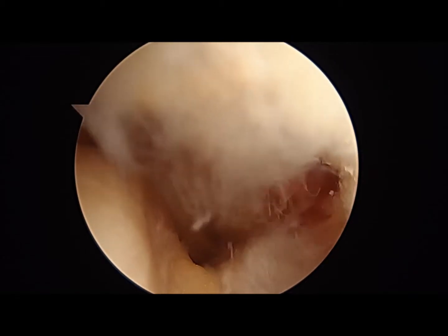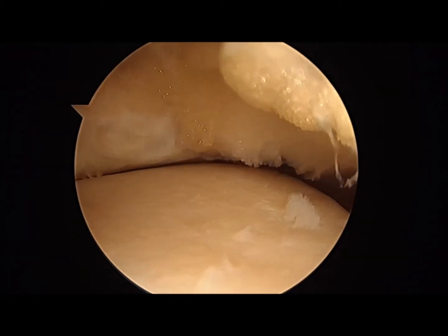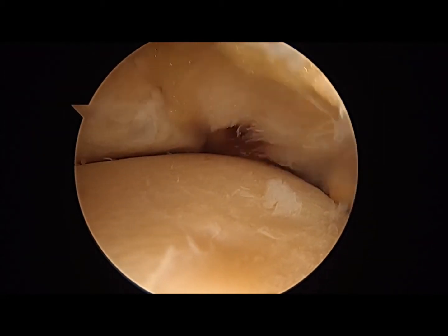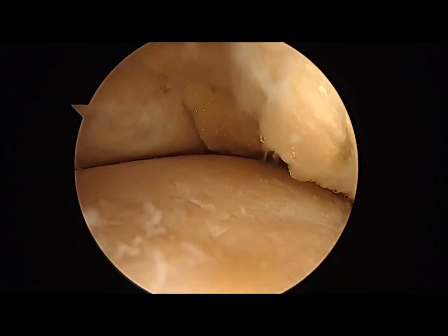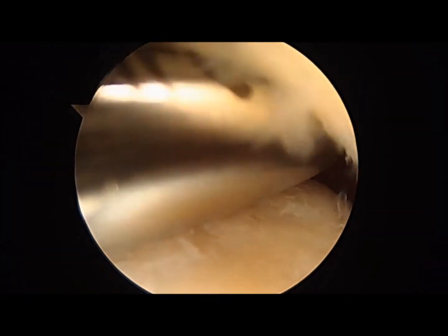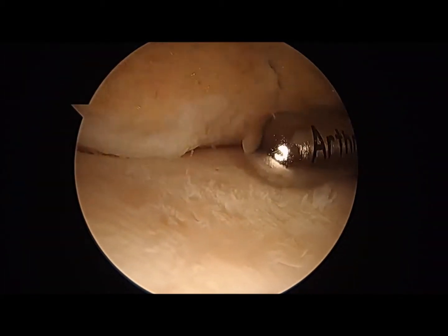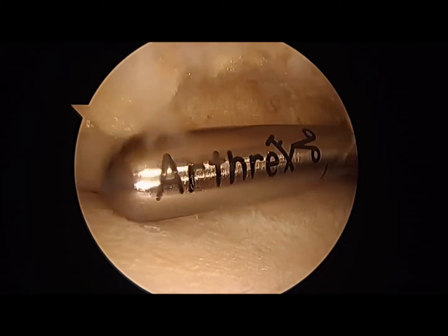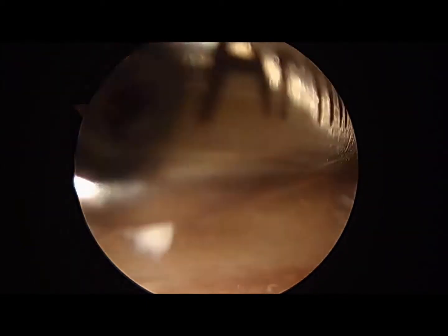Okay, now we'll take a look at this. I'm going to go toward the medial ankle now. Medial gutter, take a look at that. A little bit of synovitis there, no big deal. Going to clean all that out.